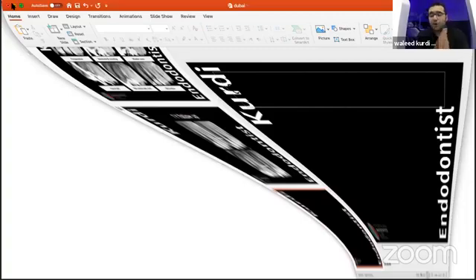But what if you are bypassing from the outer curve? You will not bypass, or you will stop bypassing it? Indeed, no. You will just be more careful during your bypassing. That's why I'm using D-Finder, because the tip is not a cutting tip, and it's much safer than C+ files. But that will not make you sure that you will not have it. You may have strip perforation even after all of that.